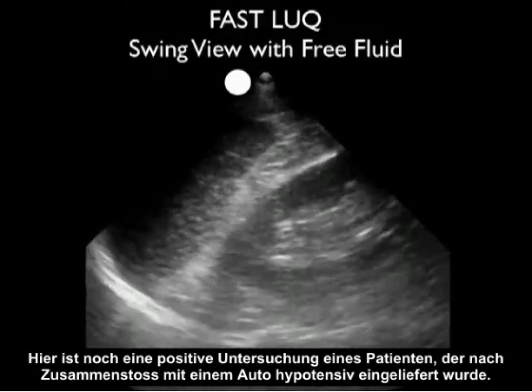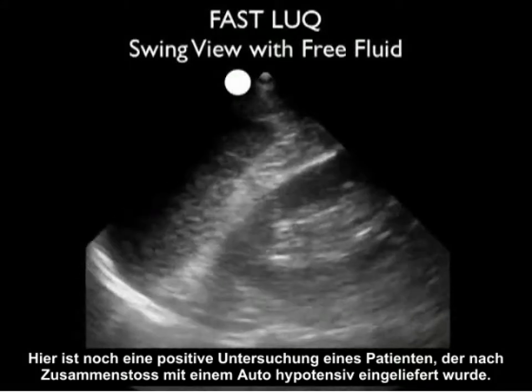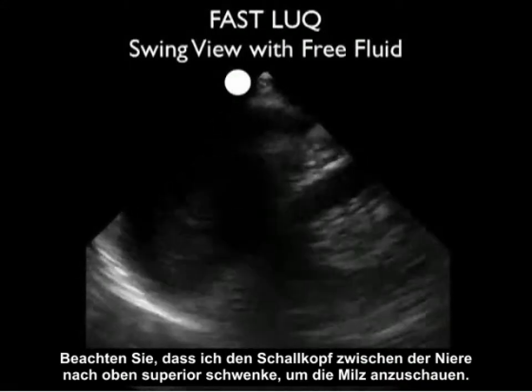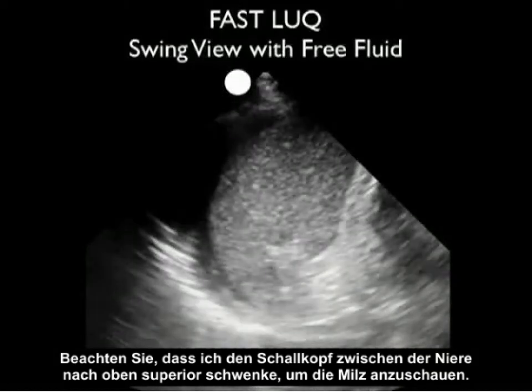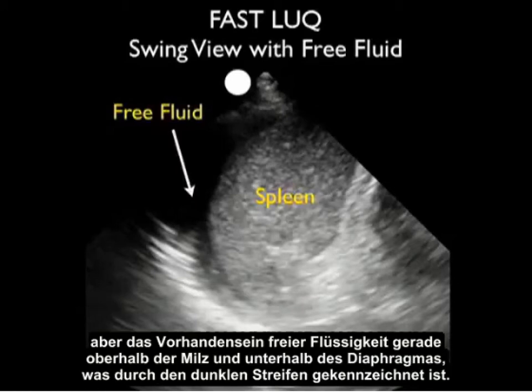Here's another positive examination in a patient who comes in hypotensive after being hit by a car. Notice I'm swinging the probe between the kidney up superiorly to look at the spleen. Notice the absence of fluid between the spleen and the kidney, but the presence of free fluid right above the spleen and below the diaphragm, indicated by that dark stripe.